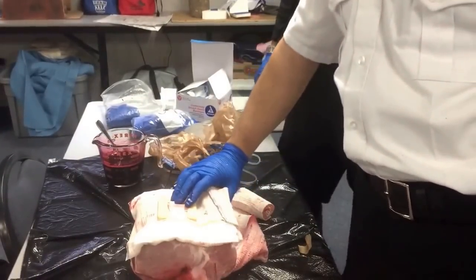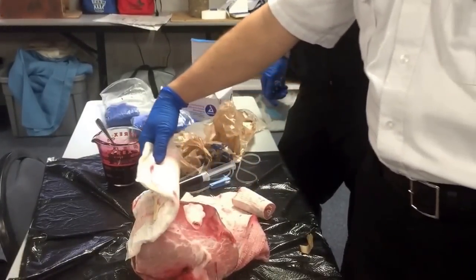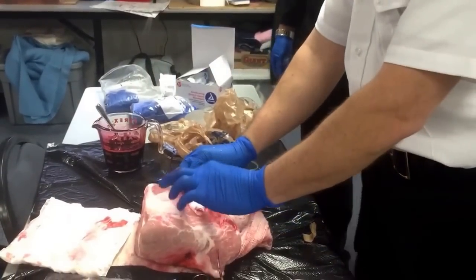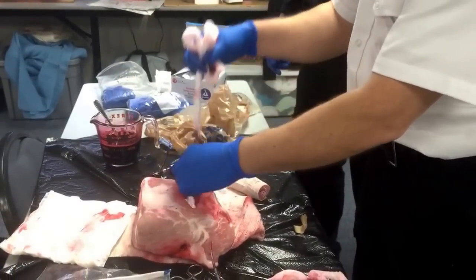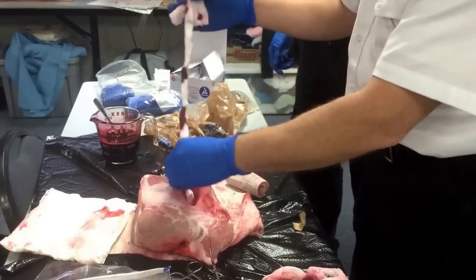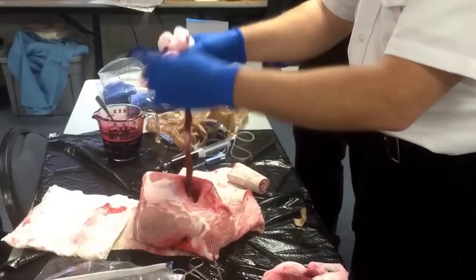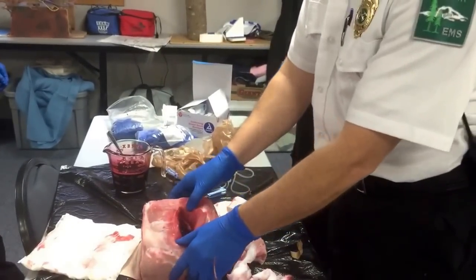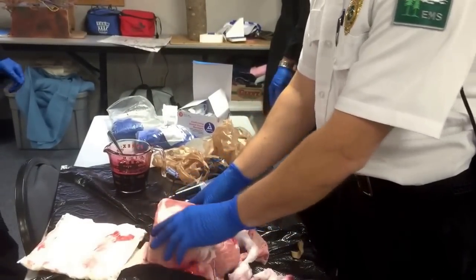Now, the benefit of this — once the patient's in the surgical theater — they take off the bandage. And now the packing, because we didn't put in a bunch of individual pieces, it's just one continuous piece. You can see the bleeding has been controlled, and it comes out all in one. The wound is now clean and ready for suture.